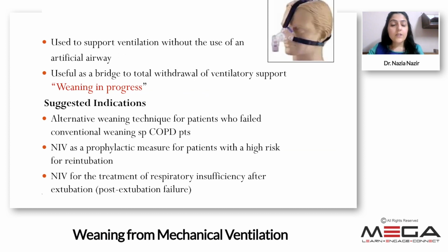Now, non-invasive ventilation is basically used to support ventilation without the use of an artificial airway, and is usually used as a bridge for total withdrawal and can be seen as weaning in progress. The indications are that it can be used as an alternative technique in patients who have failed conventional weaning, especially COPD patients.